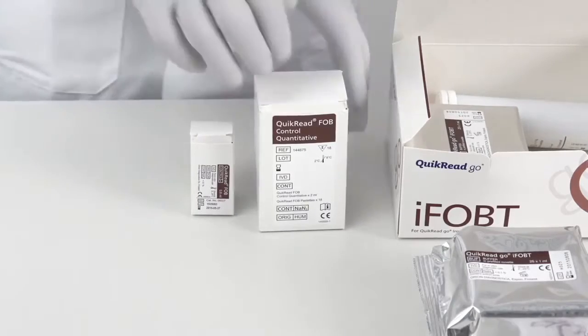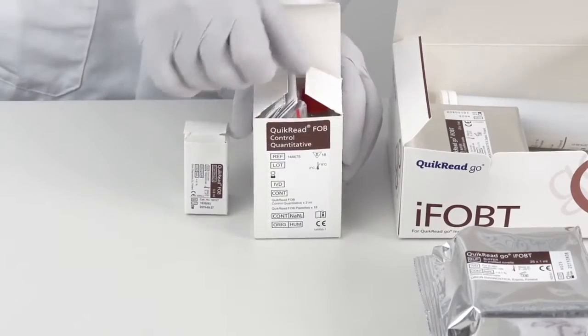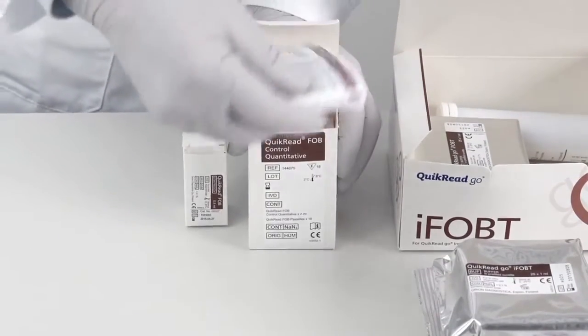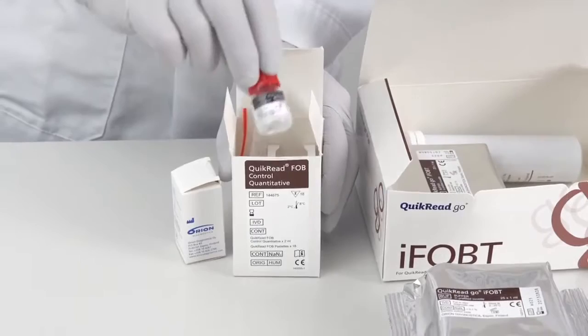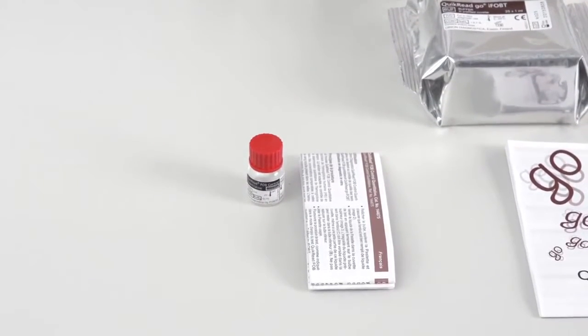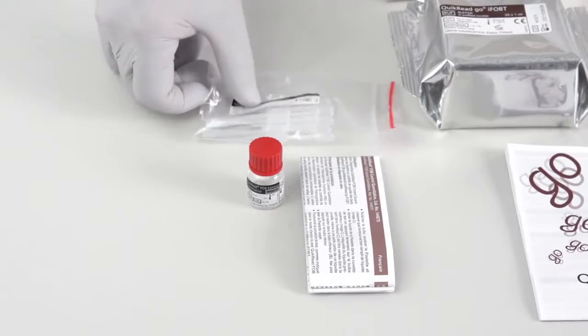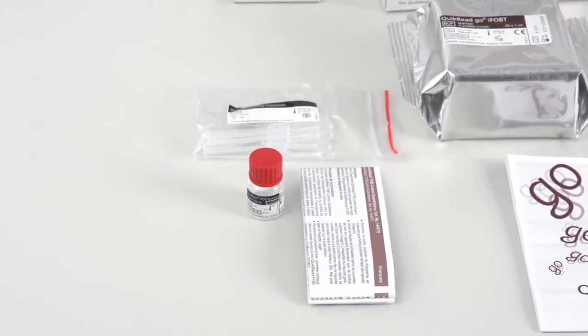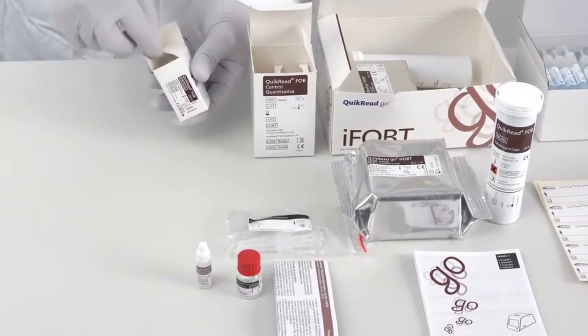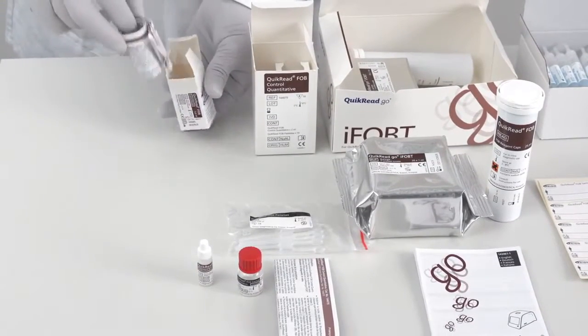The QuikRead FOB controls are separately available. The QuikRead FOB control quantitative kit contains instructions for use, a control vial, and a pastette pouch. The QuikRead FOB positive control kit contains a control vial and instructions for use.